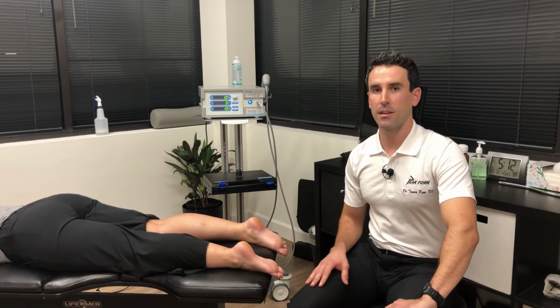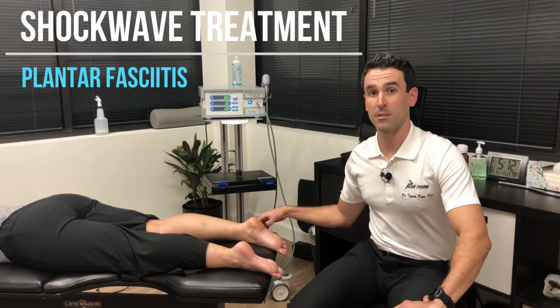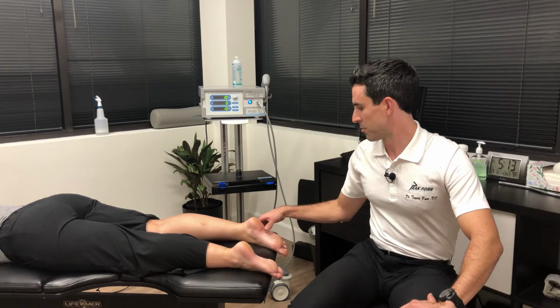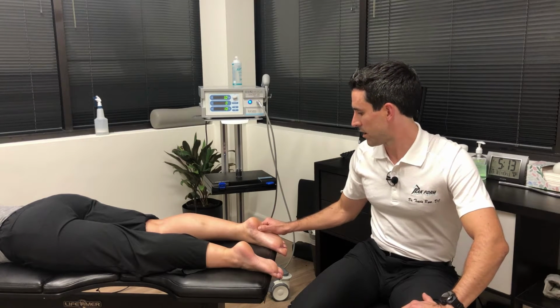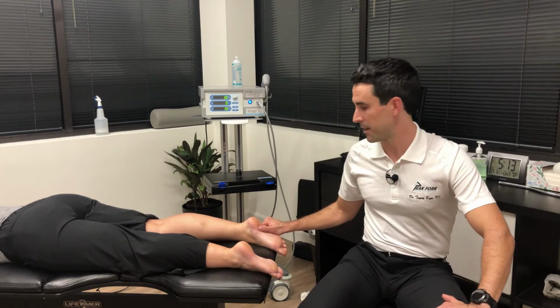Okay, we're in the office today and we are going to be treating a patient for plantar fasciosis. She's been dealing with plantar fasciitis type symptoms for over 10 years now. Her primary activity is dance, and she has been having just constant heel pain on the bottom part of her heel, right where that plantar fascia inserts at.